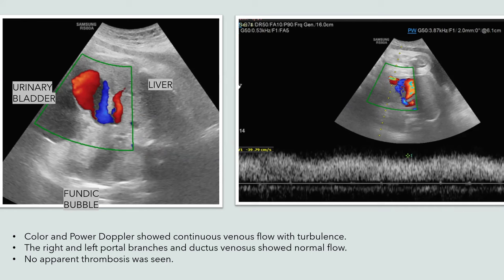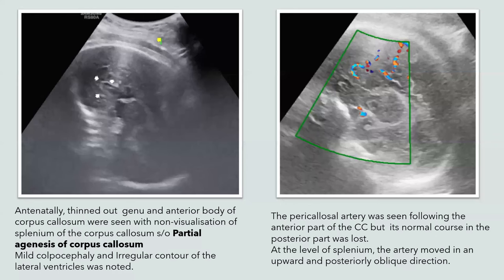The right and left portal branches and ductus venosus showed normal flow and no apparent thrombosis was seen. Antenatally, thinned out genu and anterior body of the corpus callosum was seen with non-visualization of the splenium, suggestive of partial agenesis of corpus callosum. This was associated with mild colpocephaly and irregular contour of the lateral ventricle. The pericallosal artery was seen following the anterior part of the corpus callosum, but its normal course in the posterior part was lost, and at the level of the splenium the artery moved in an upward and posterior oblique direction.